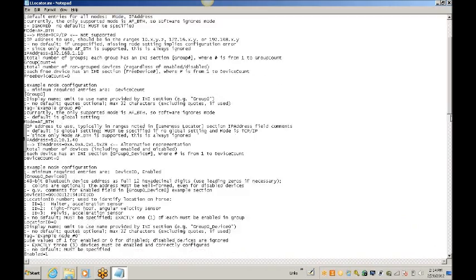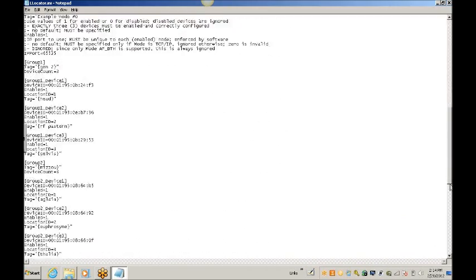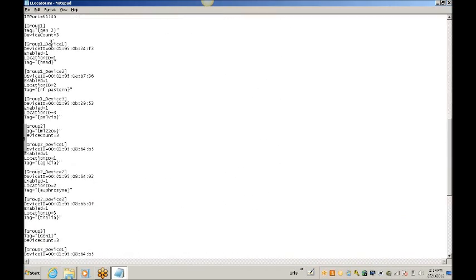And you can ignore most of this and scroll down to the bottom half of the page where you will see several groups of paragraphs. Depending on how many sets of sensors you will have, that will dictate how many groups you have. So you can see here I have group 1 with 3 paragraphs following it, and then group 2 with 3 paragraphs following it, group 3, etc., etc. I have 4 groups of sensors here.